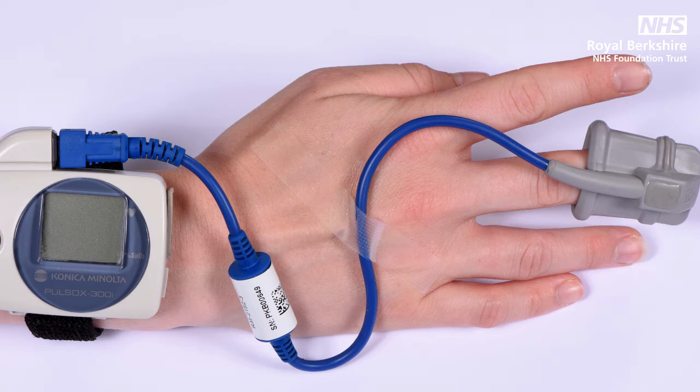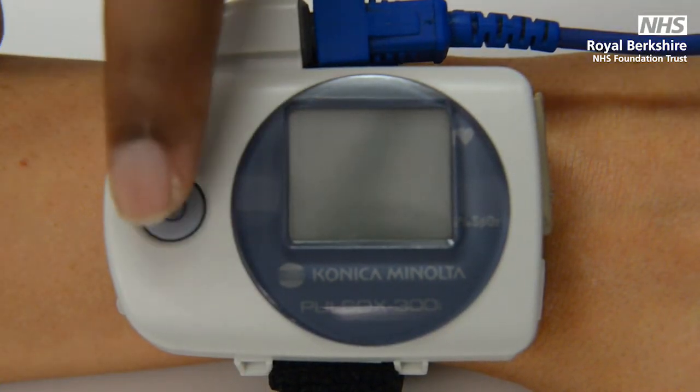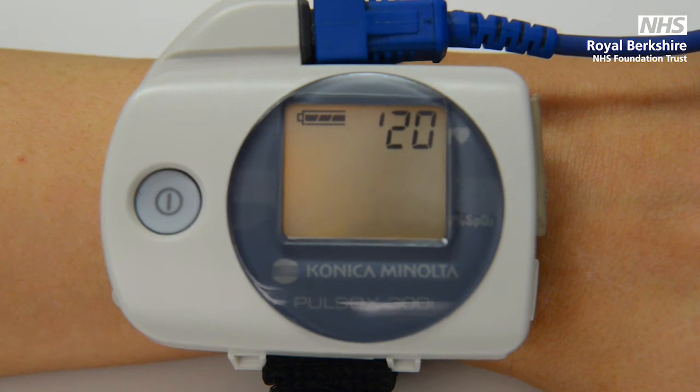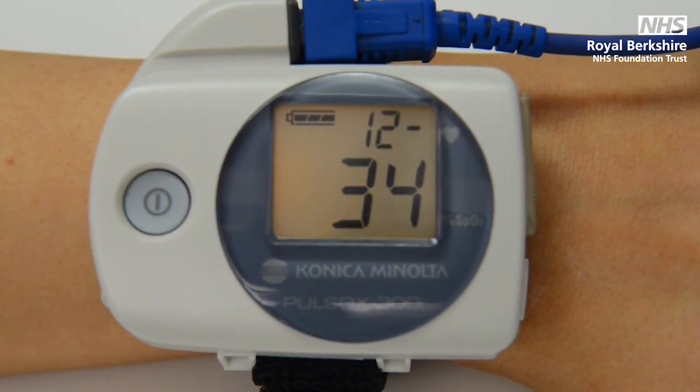Please make sure that you are not wearing any nail varnish or false nails. To turn the machine on, press and hold down the power button until the screen comes on. After a few seconds, you should expect to see two numbers appearing on your screen, indicating your oxygen saturation and heart rate.